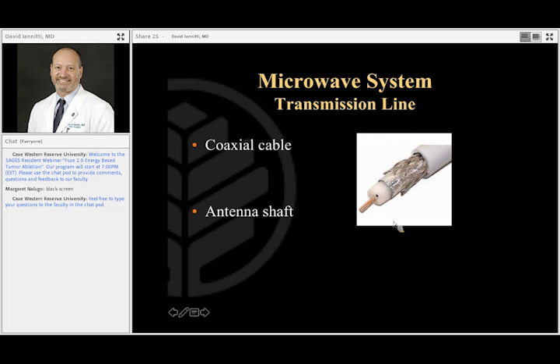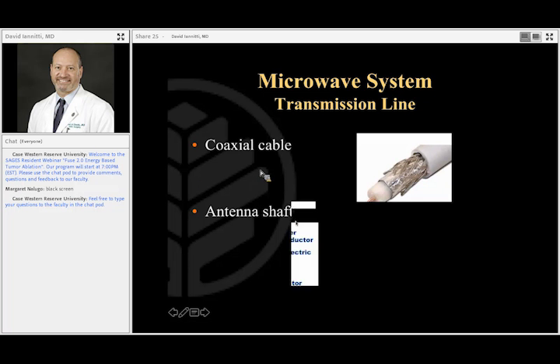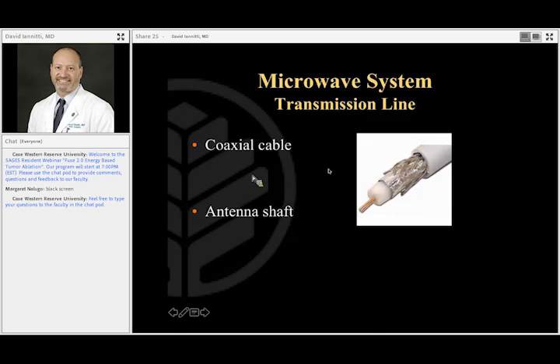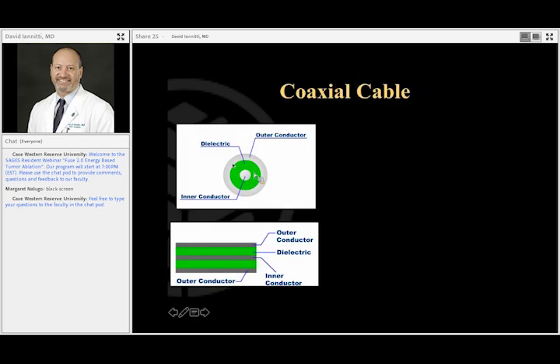I'm sure everybody who's wired up their TV knows what coax is. And so basically, coax is an inner conductor, right? The inner copper right there, that's your inner conductor. Then you have Teflon around the inner conductor, and that is invisible to microwave. Then you have an outer conductor and then an insulator on the outside. So here's the outer conductor here.